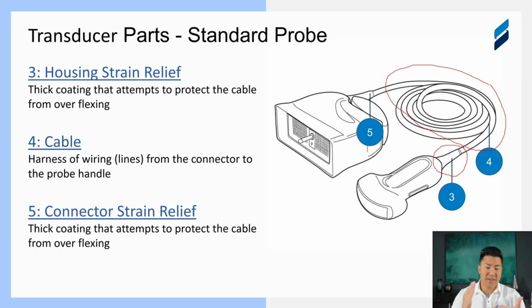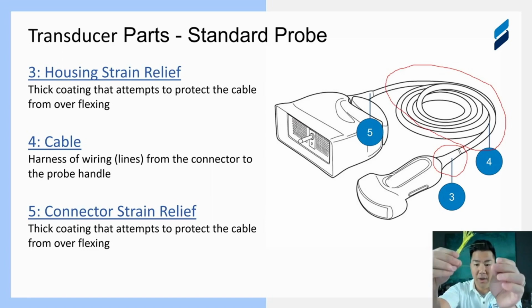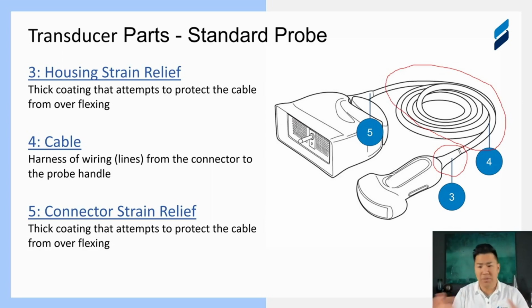Again, look at that when you're looking at probes. You might see some track marks of casters running over the cable, because the cables do hang down, touch the floor, moving that machine around. Very easy to accidentally run over the cable. And again, you have a several 100-pound cart machine running over these kinds of wires on the inside. Just physics takes place. That's just a lot of force on a really small component there.